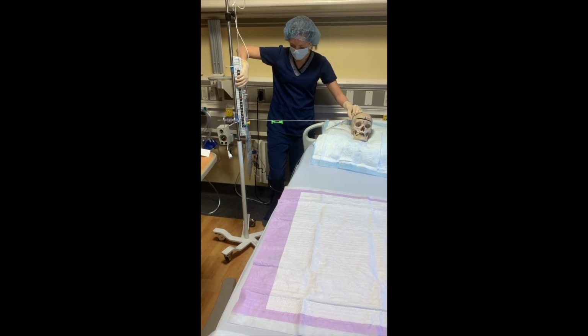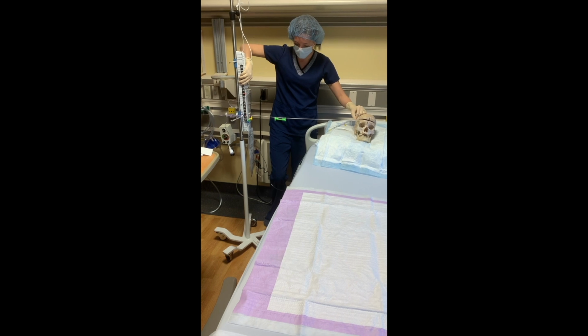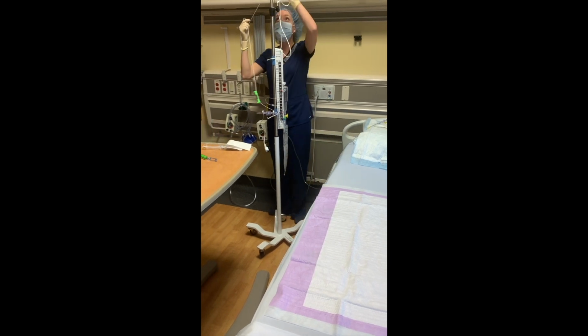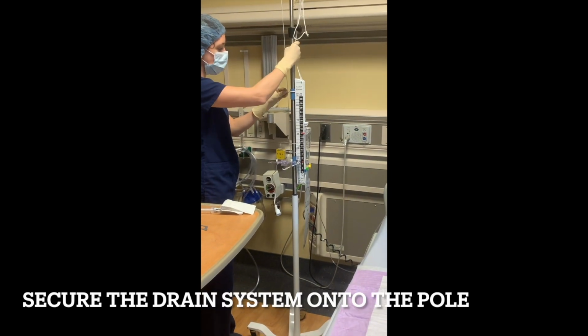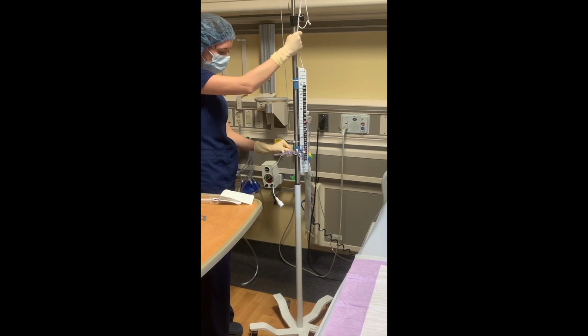Once the collecting system is loosened on the IV pole, grab the string and carpenter's level and place it towards the patient's external auditory meatus. Move the collecting system up and down until the carpenter's bubble is level. Once this is done, you'll need to re-adhere the collecting system to the IV pole to ensure that it does not move up or down.